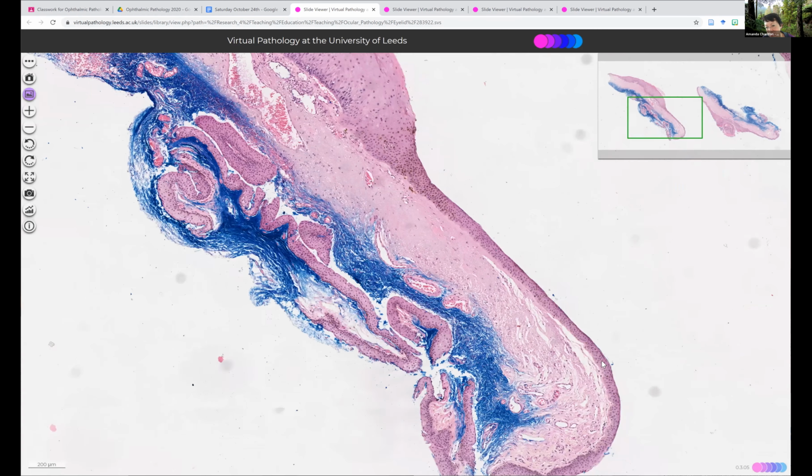If it is a tripolar mitosis, then that brings to my mind, is this dysplasia? Because atypical mitotic figures, thickened epidermis with irregular distribution of the nuclei in a severely sun-damaged surface, squamous intraepithelial neoplasia is what I'm thinking.